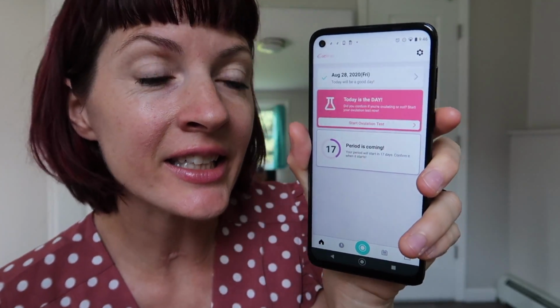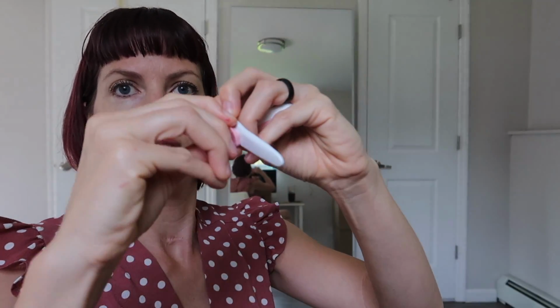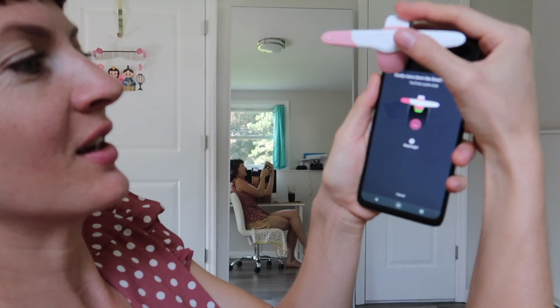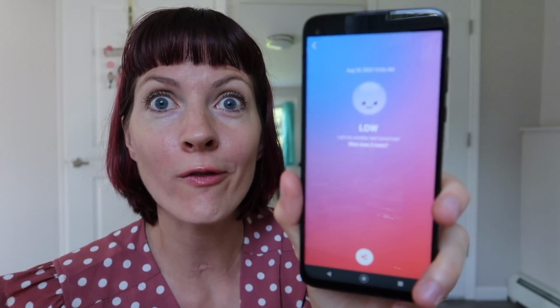But I'm still gonna do one more test to see if it says, you know, oh, you passed your peak, hope you did it. I don't know. So I'm gonna go do that now. There's my Eveline. Today is the day. Start your ovulation test now. Gotta take off the protective cap, then you snap it in, click, and now we put it on here. See, it's so sensitive. Okay, almost there. Finally got it in the right position and held it there long enough to analyze, and low fertility.